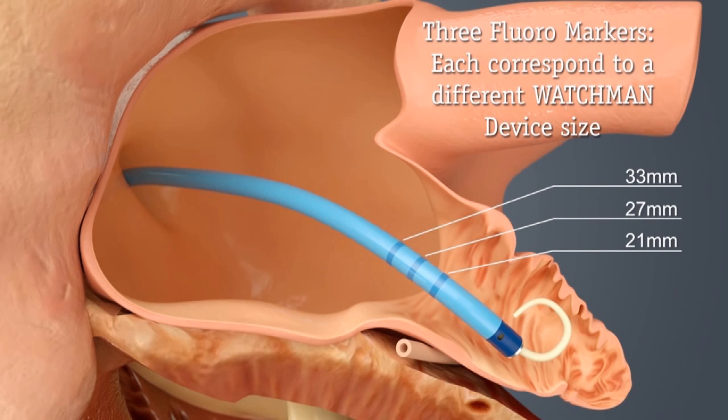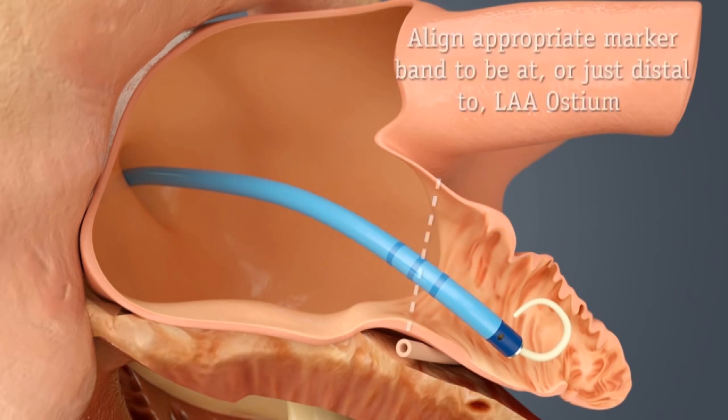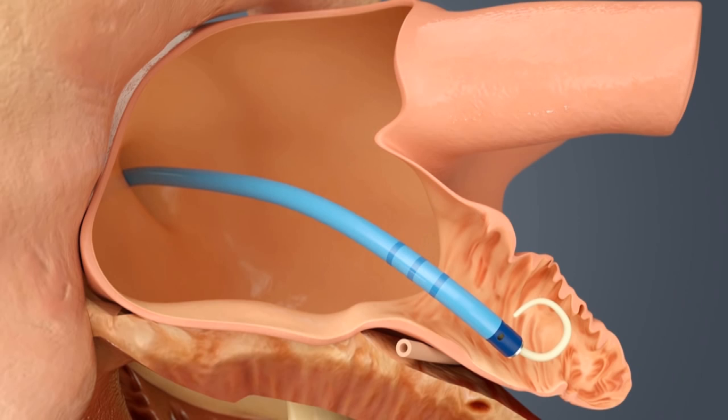As you can see, the catheter is marked and helps us determine the size of the device we need. At this point, we take a confirmatory picture of the appendage with contrast dye and then pick out the right size device to use.